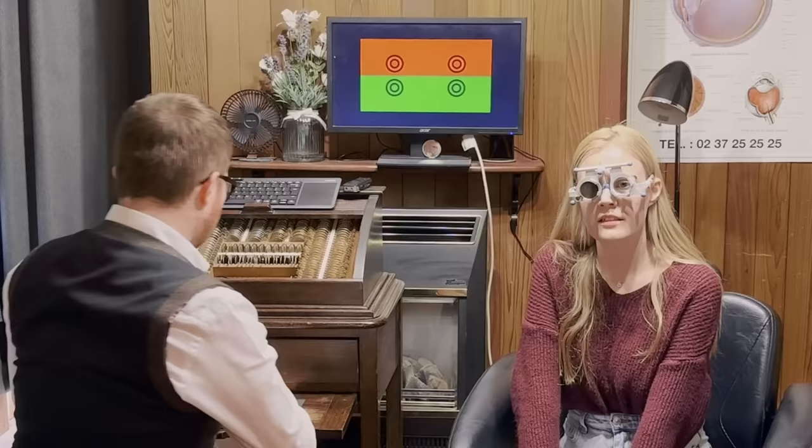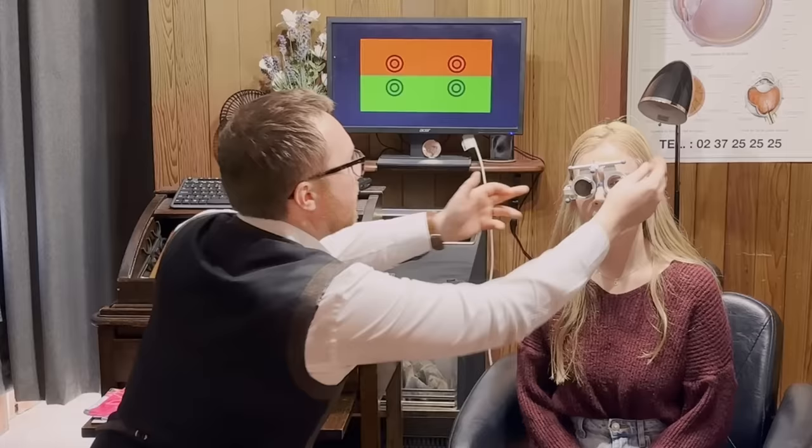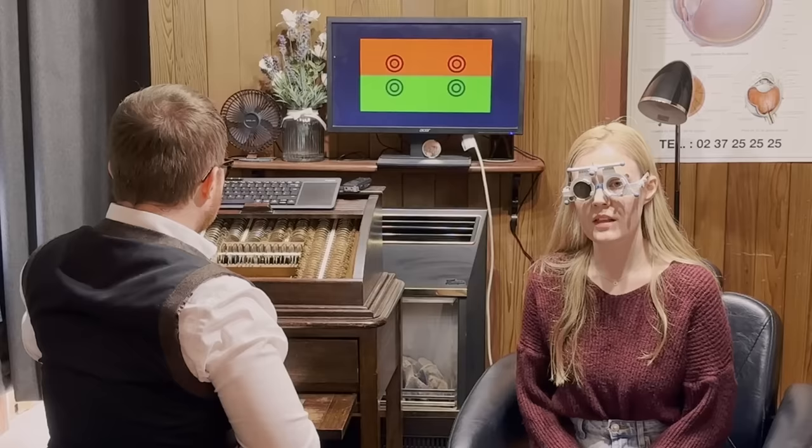Just going to swap. Isn't it very blurry for a second? And how are they looking now on the red and the green? The green's clearer now. Yeah, brilliant.